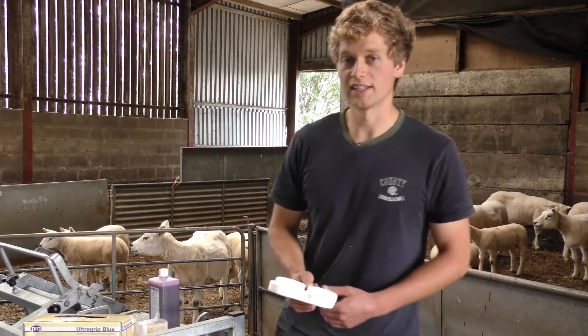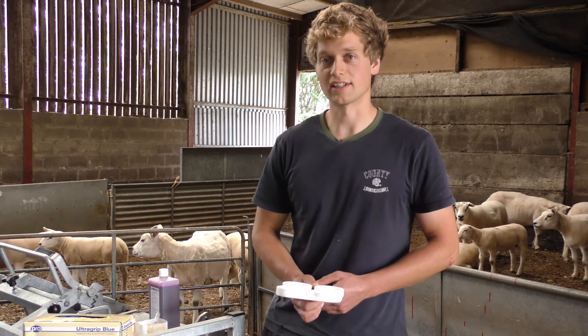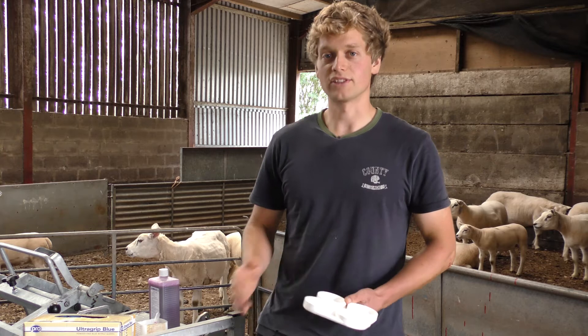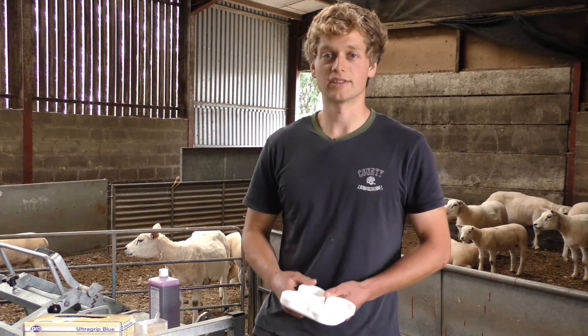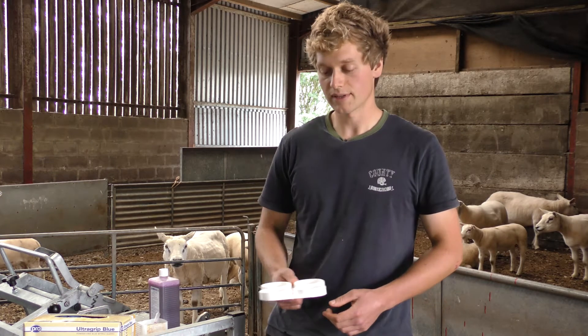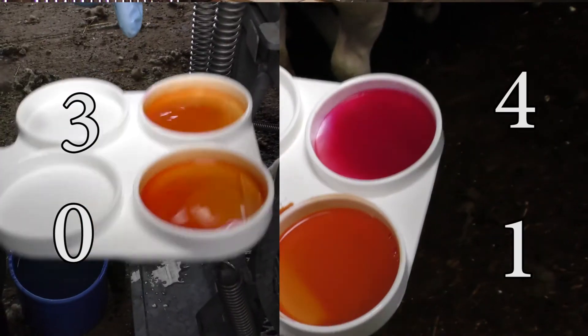The basis of this test is aimed to assess the consistency of the mixture. Essentially the thicker the mixture goes the more mastitis there is in the milk. It's very important to begin grading as soon as you can, otherwise the mixture may dissipate.